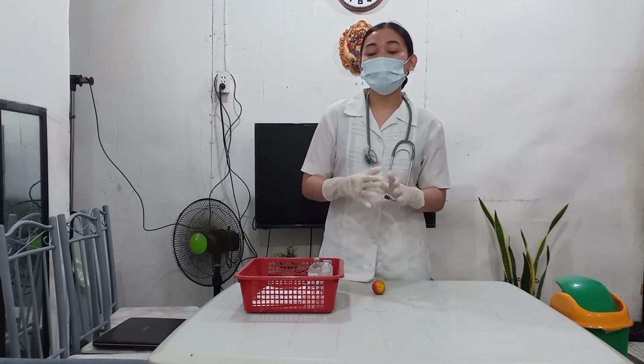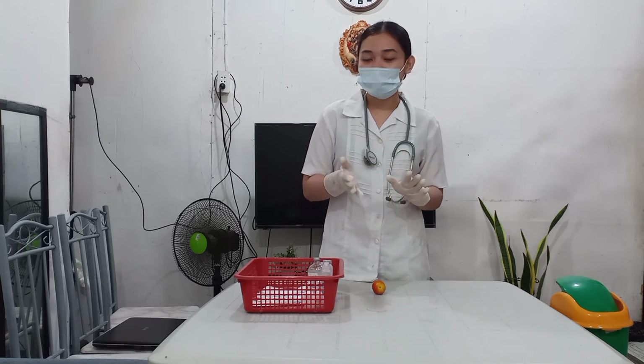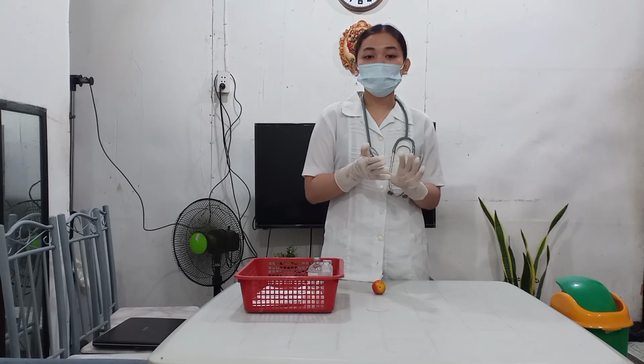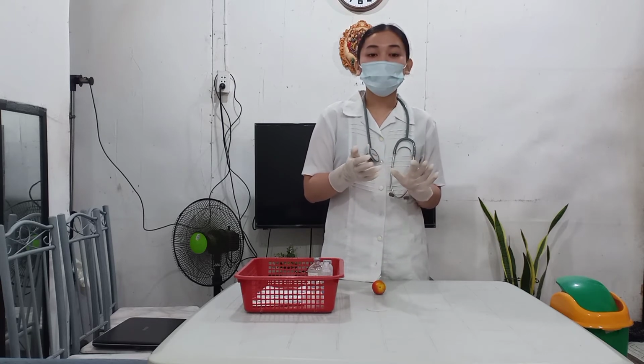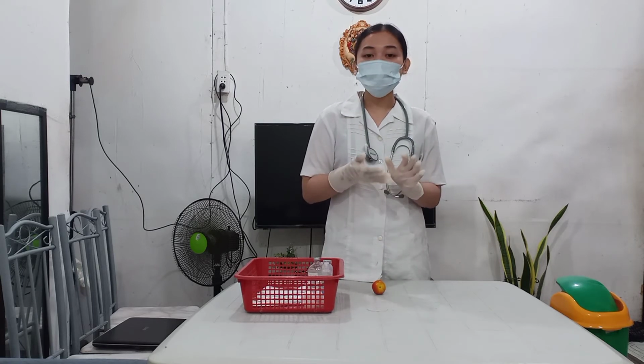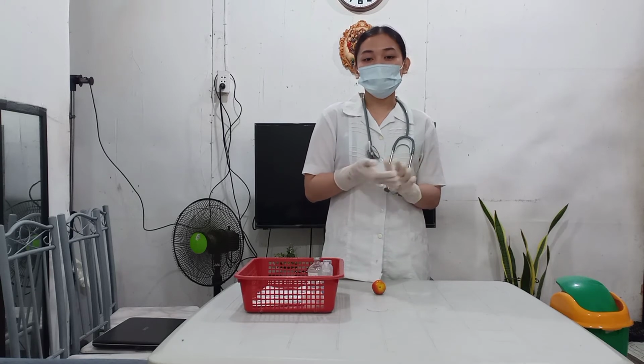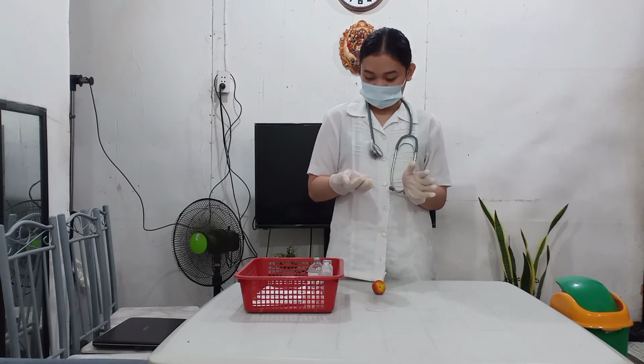Since I've already done washing my hand and I've already donned my gloves, I will now be proceeding to the second step, which is to prepare the medication from the vial or ampule for drug withdrawal. Because organization of necessary items for the procedure facilitates accurate skill performance.